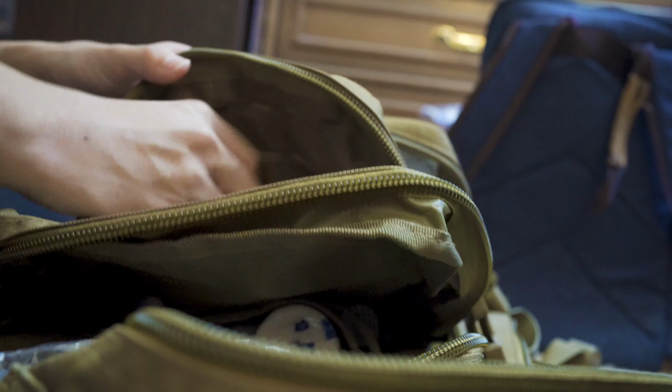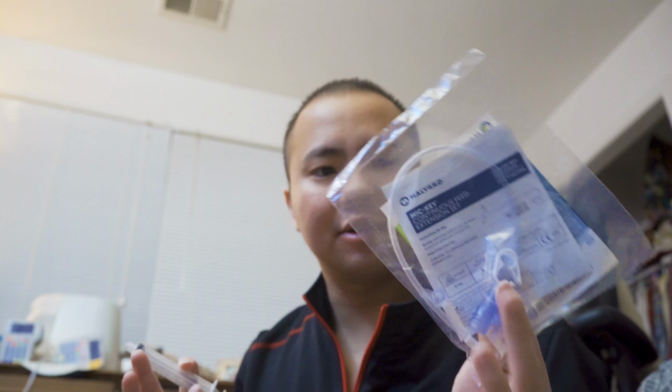But if you do need lotion, you have this little pack now to put all your miscellaneous stuff in here. Next are these syringes. This is the bag that the G-tube usually comes in, so I would just switch this out. So the syringes we're going to put in the front pocket, because I use these syringes to help vent for the G-tube.